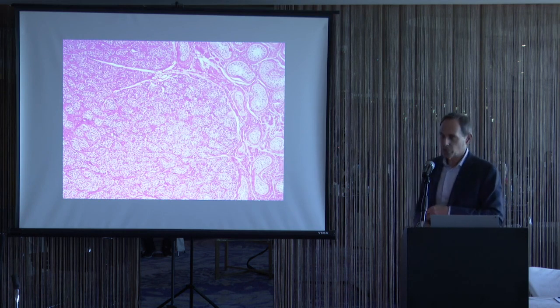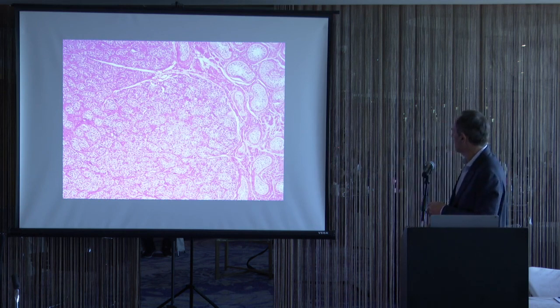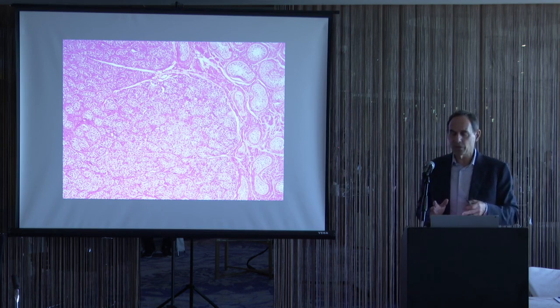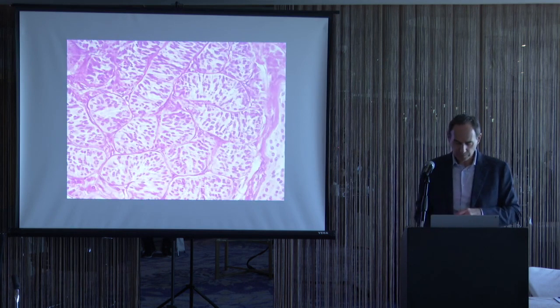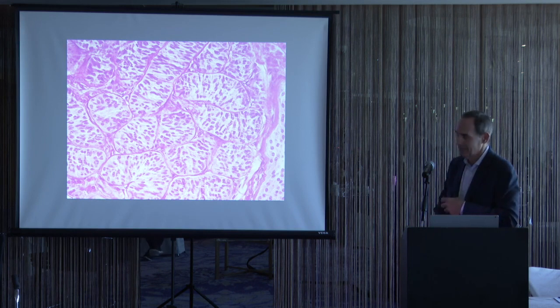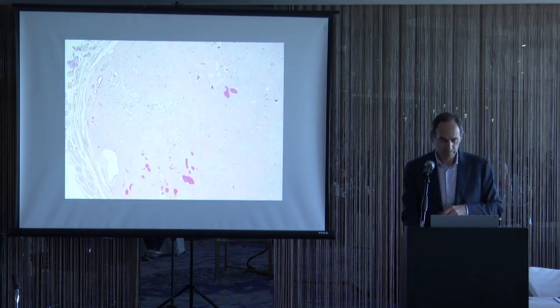The other pattern of Sertoli cell nodules are when they look like immature seminiferous tubules, reminiscent of what you would see in a fetus. In contrast to, these are the adult seminiferous tubules. And they form these multiple nodules. They can be sizable, but as long as they're multiple or they have these morphologies, you don't call them tumors. These are just Sertoli cell nodules. Here at higher power, these immature, in a Sertoli cell nodule, these packed, immature little nests that individually look pretty indistinguishable from neonatal seminiferous tubules.